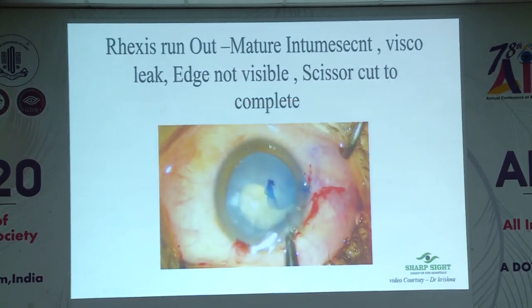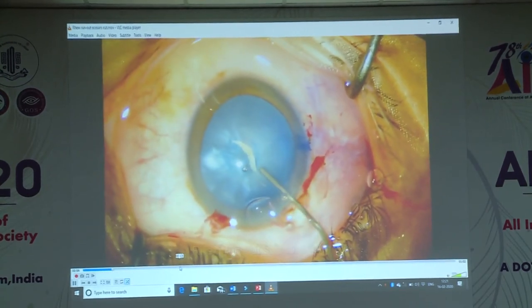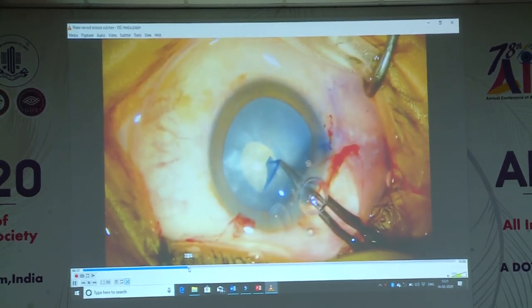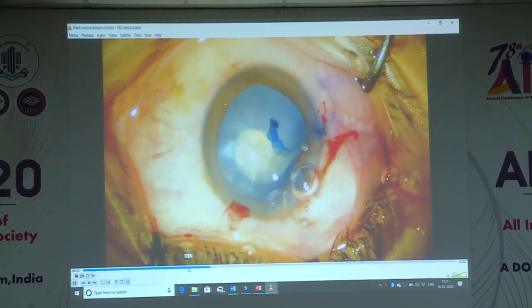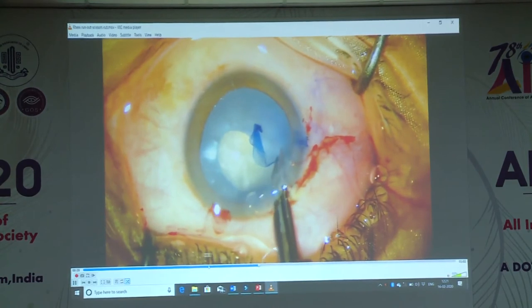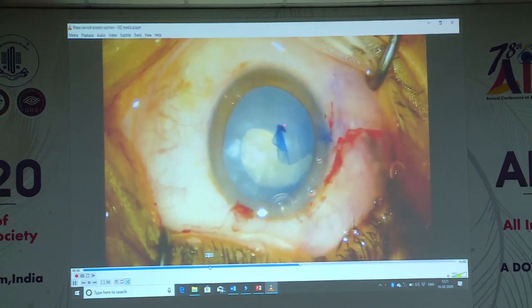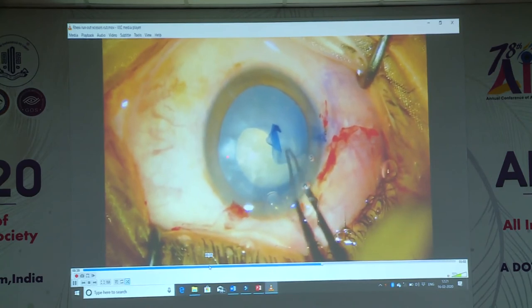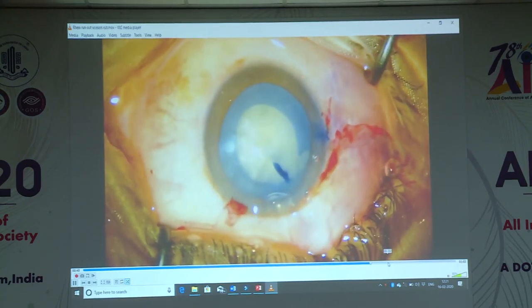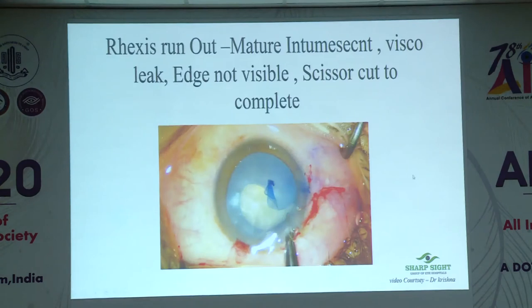Another situation: capsule rhexis going out again with high intralenticular pressure and viscoelastic in. The mistake here is that I am not monitoring the viscoelastic leak. The moment a bubble comes out the pressure drops and the rhexis extends. Bottom line: whenever anterior chamber pressure goes down, centripetal forces reduce and the rhexis extends. How to manage it: extend it with a linear cut — but not a very large linear cut, so you don't encroach another tangential area. Make a smaller linear cut, push in viscoelastic, then round it off again. Lower the intralenticular pressure by taking out the fluffy cortical matter and then proceed with surgery.